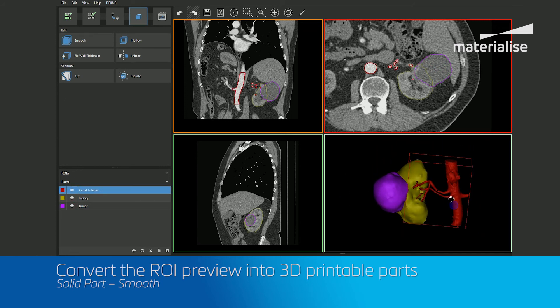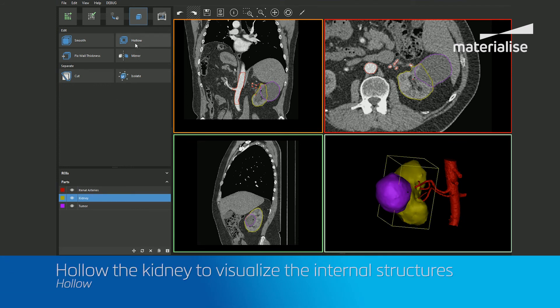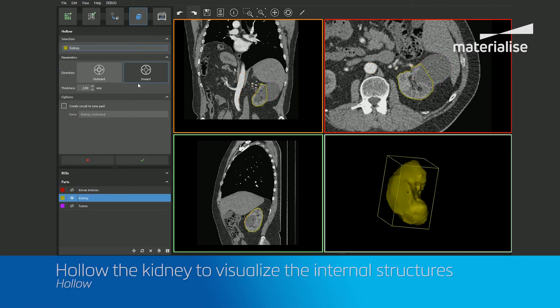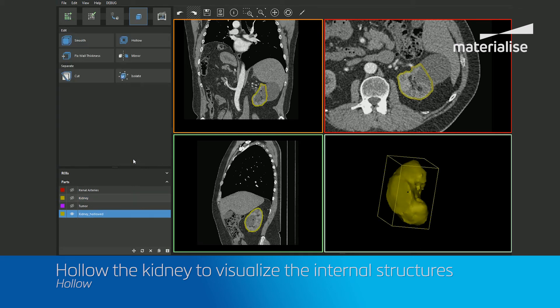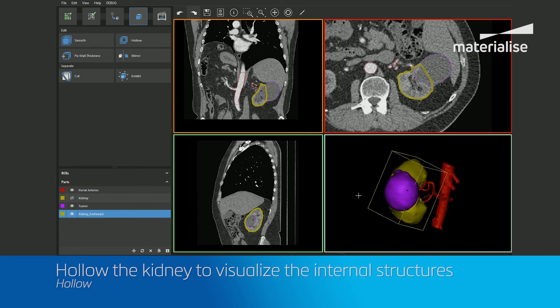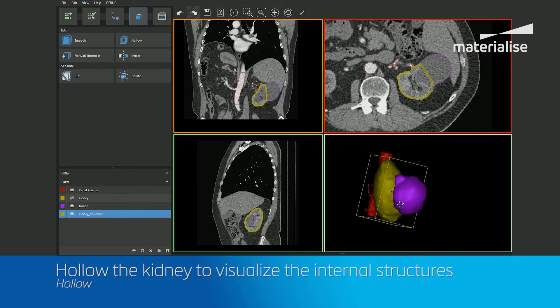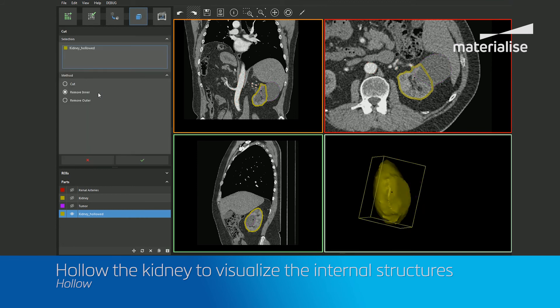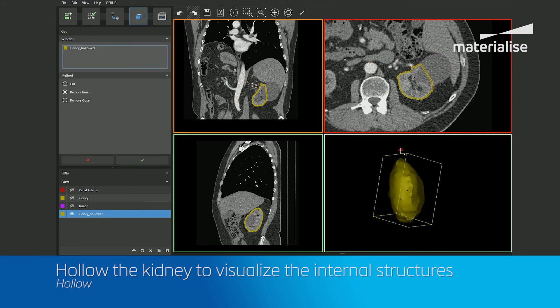With the parts calculated, we can perform a smooth operation to obtain a higher quality model. Now, in order to better visualize the internal relationship of the renal arteries and tumor, we can hollow the kidney to the inside at a user-specified thickness. And once the kidney is hollowed, we can then cut the kidney open using the cut tool.